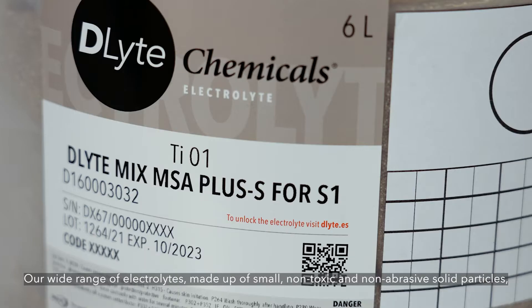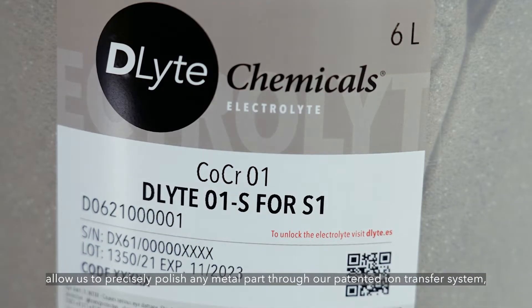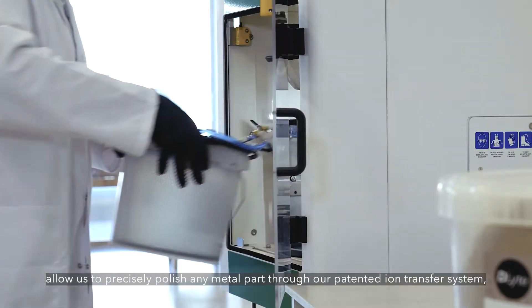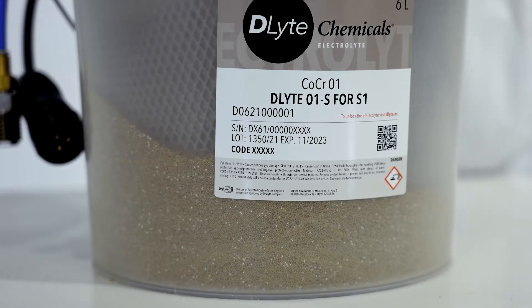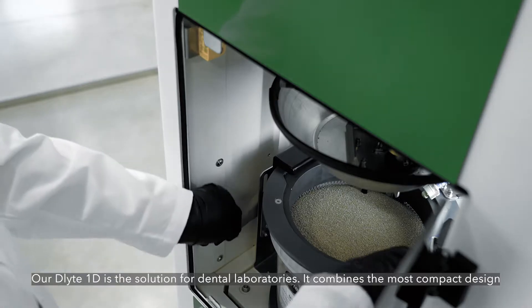Our wide range of electrolytes, made up of small non-toxic and non-abrasive solid particles, allow us to precisely polish any metal part through our patented ion transfer system, removing material only from roughness peaks without rounding the edges.